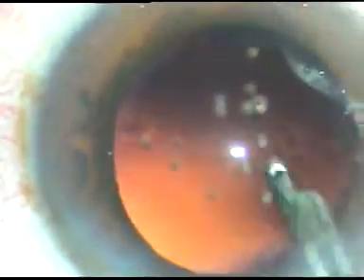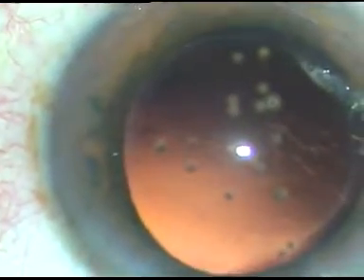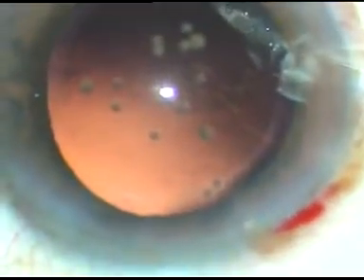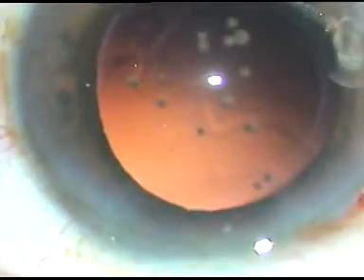Now we can see some cells sticking to the posterior capsule, which are dislodged by the fluid wave. We must polish the posterior capsule — we must not leave those cells. This is the irrigating probe of bi-manual IA. I direct the jet of fluid towards those cells, and see how nicely the cells get dislodged and the capsule gets polished. This can be called hydro polish — you are using fluid to polish the posterior capsule.